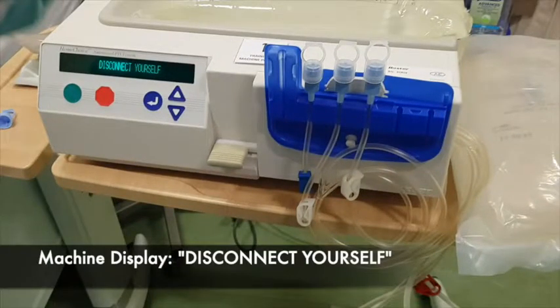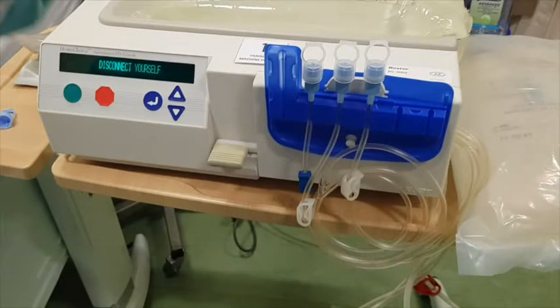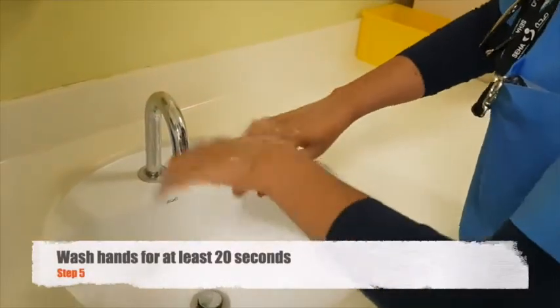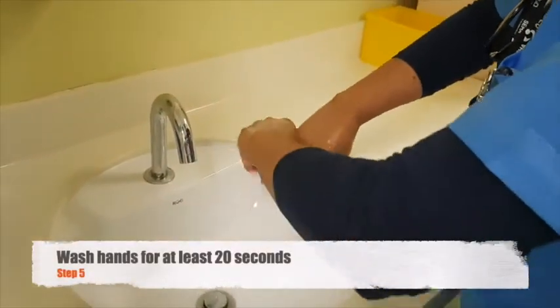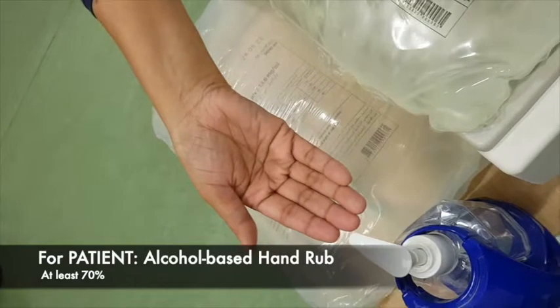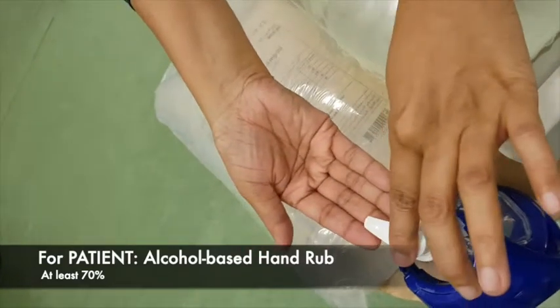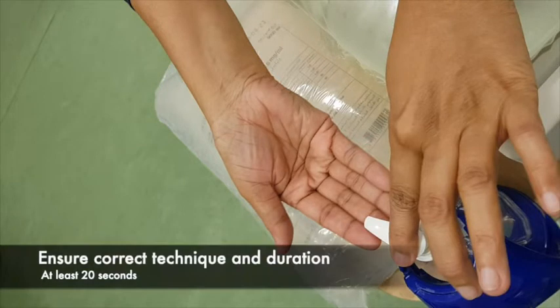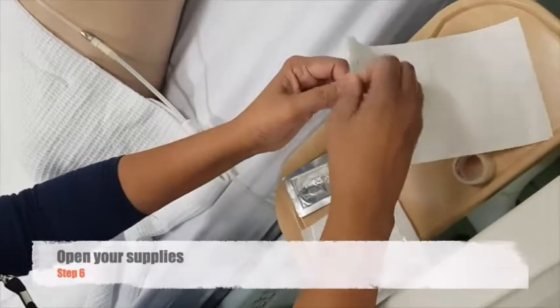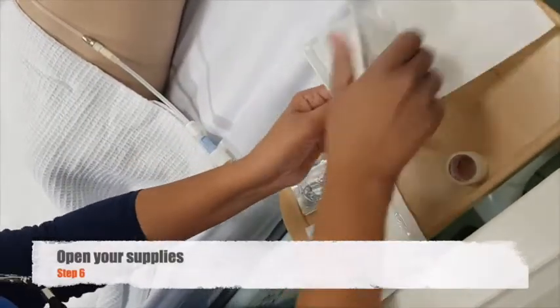After some time, the machine will prompt you to disconnect yourself. While waiting, you can wash your hands for at least 20 seconds. However, if the patient is doing his own PD session, you may opt to ask the patient to do an alcohol-based hand rub. Make sure that the patient will use the correct technique for at least 20 seconds. Proceed to open your supplies.